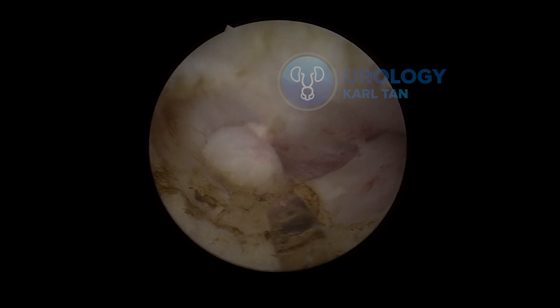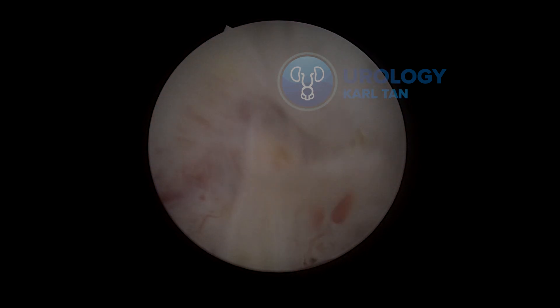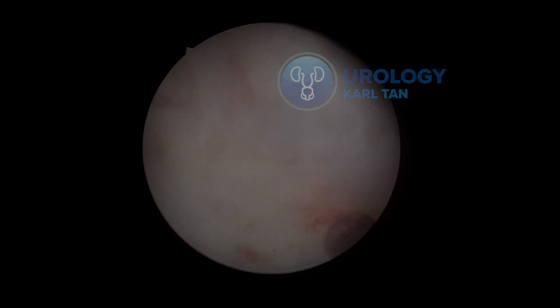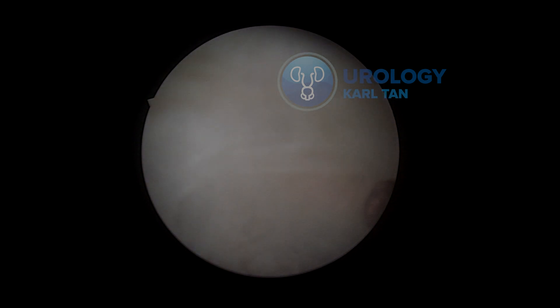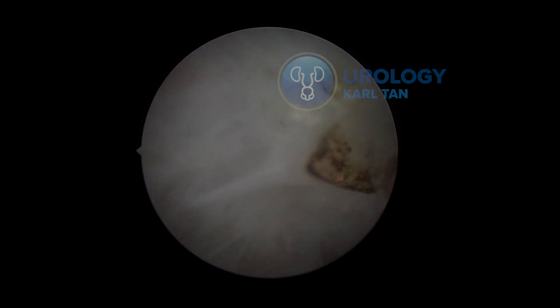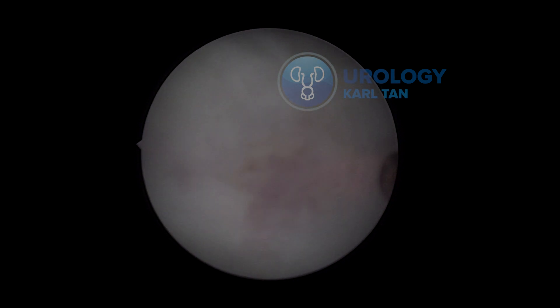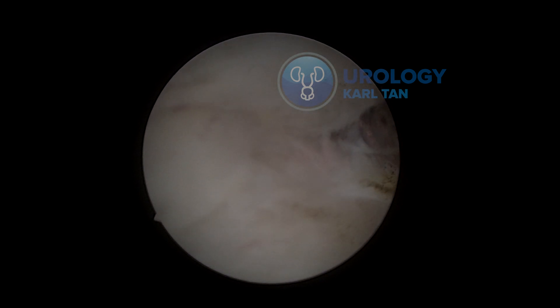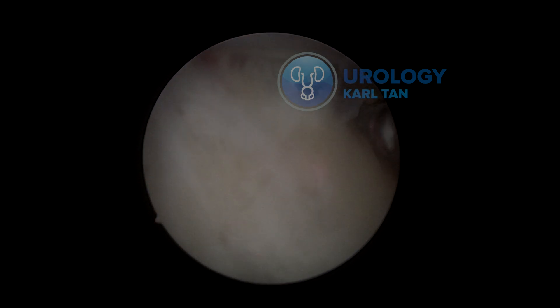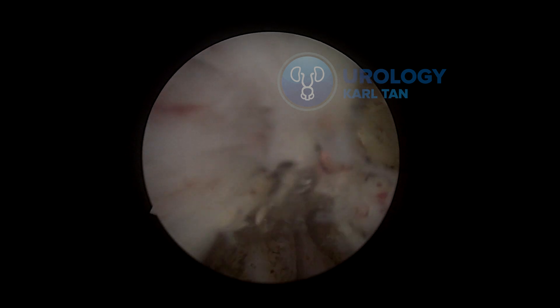This is how I try to get the plane between the prostate gland and the capsule. You always need a somewhat mechanical push to be able to get into that plane. If I find it a little bit sticky or adherent to the capsule, I would use the laser to cut through the prostate, cutting closer to the prostate and not through the capsule.